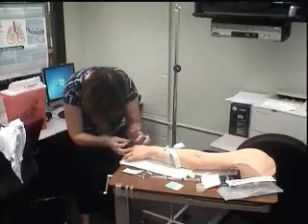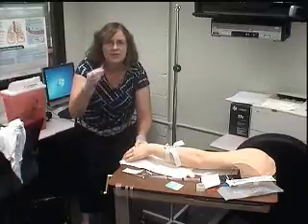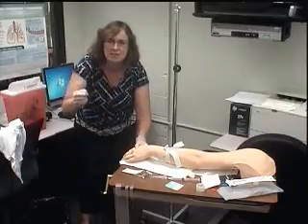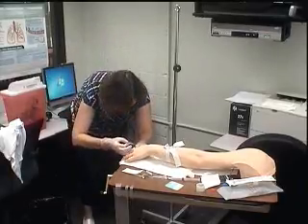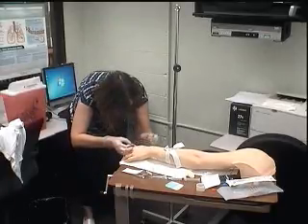Keep your thumb off of this. You want that to be sterile. You don't want to be touching all over this stuff. This is sterile. This is an aseptic procedure. So go in, boom, I see blood. Flashback is coming all up inside this pink.